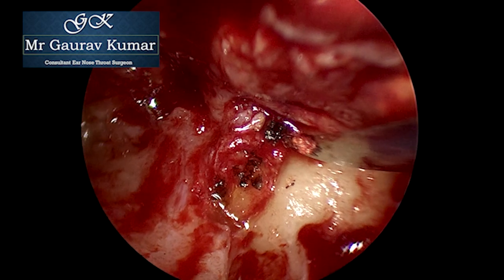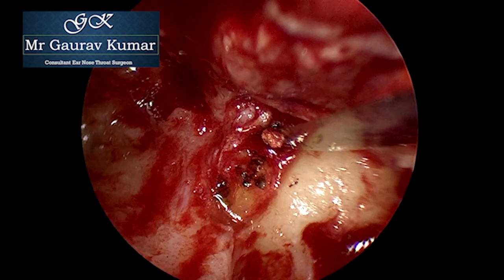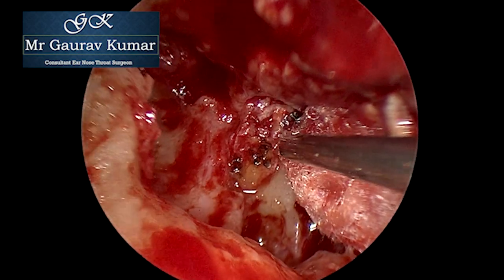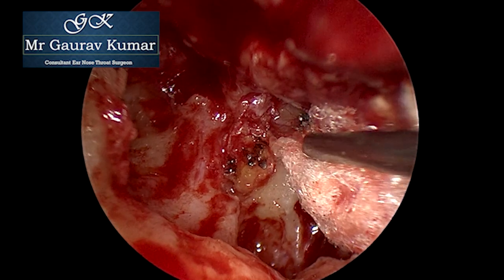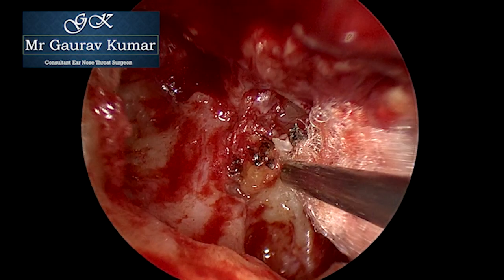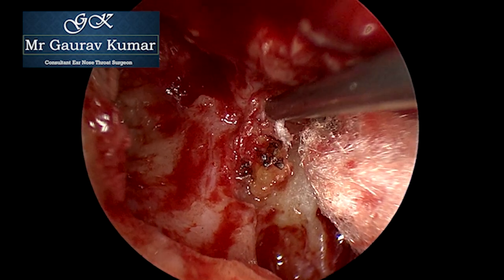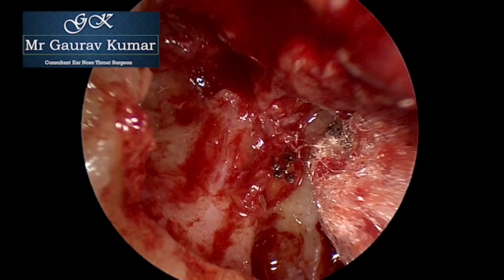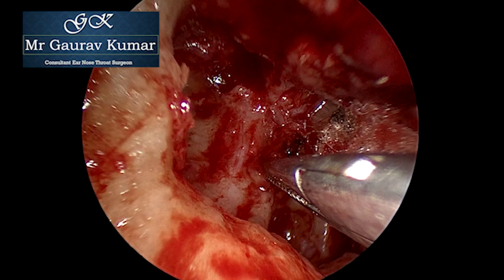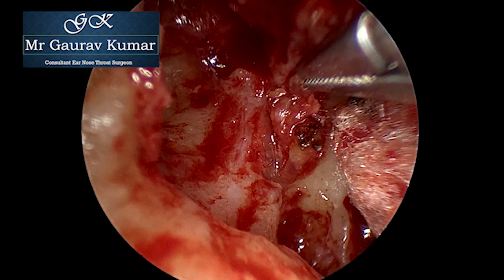Once dissection has delineated the posterior crura of the stapes, the anterior crura is carefully dissected with cold steel and laser dissection. We have to be careful when dissecting the anterior crura as that is the thinner crura of the stapes. As there was no dissection plane between the medial surface of the stapes crura and the cholesteatoma, laser was used to dissect and create a plane there.